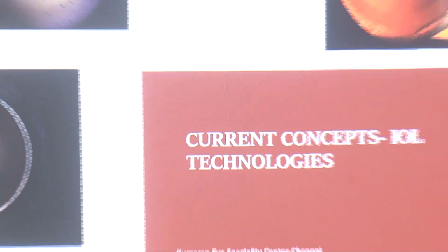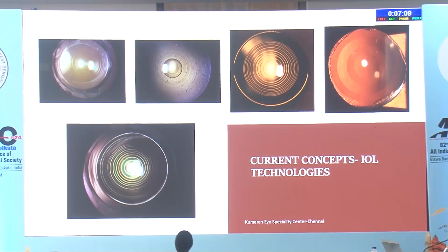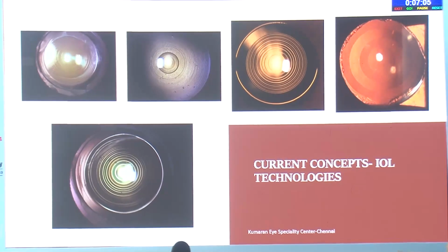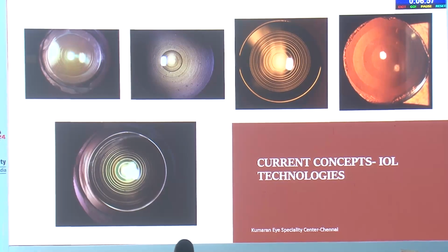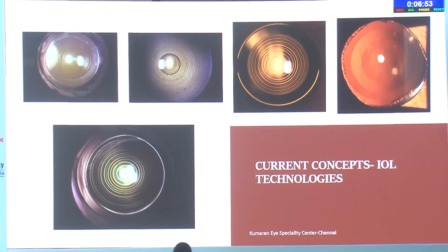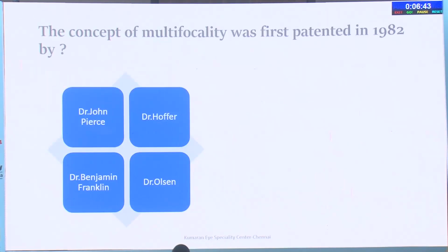So this is how all the multifocal IOLs evolved. Do you know how many technologies there are to correct presbyopia with IOLs? Any answers for that? There are 9 different technologies involved in a multifocal IOL or a trifocal. All we know is diffractive, refractive, diffractive-refractive, and EDOF. But there are also other technologies involved, which I'm going to talk about. We only talk about the technology, but the other things we have to look into are the IOL materials, the IOL design, and the IOL properties also.